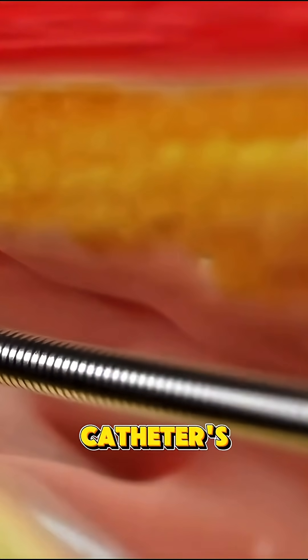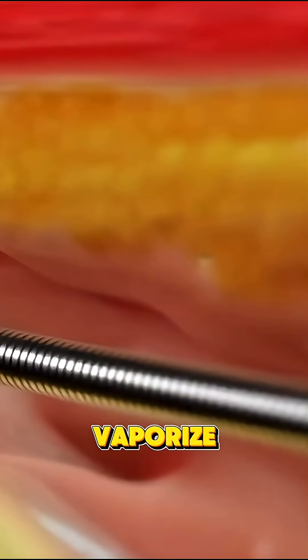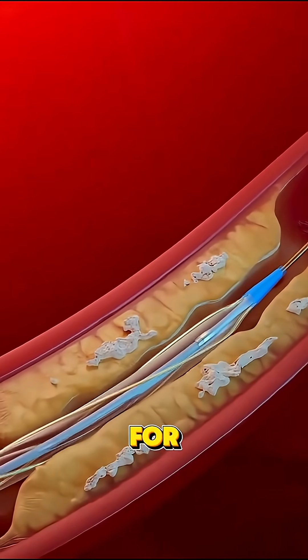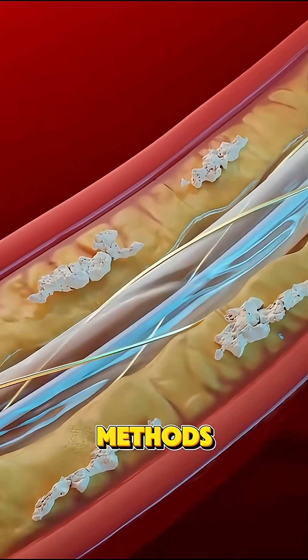Once in place, a laser fiber at the catheter's tip emits pulses of ultraviolet light that vaporize the plaque — it literally turns it into gas and tiny particles without harming the artery wall. The process is super precise and ideal for hard calcified plaques that are tough to remove with traditional methods.